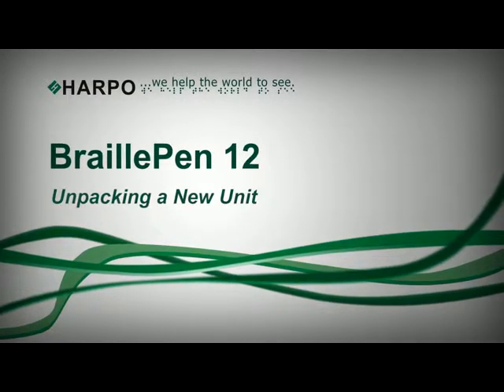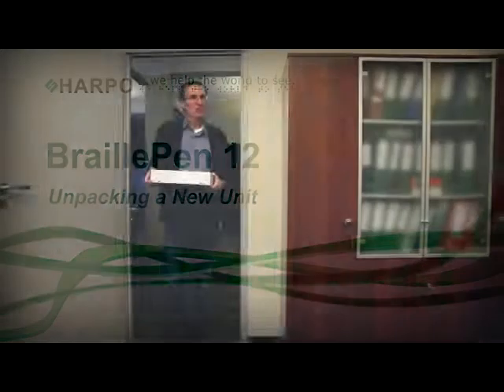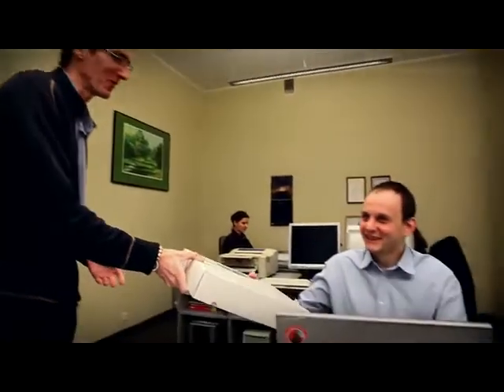Braille Pen 12. Unpacking a new unit. What do you get when you get a Braille Pen 12? The Braille Pen 12 is a Bluetooth Braille keyboard and 12-cell display.